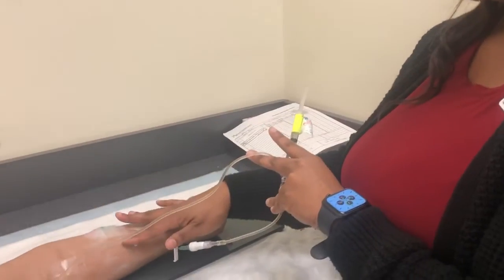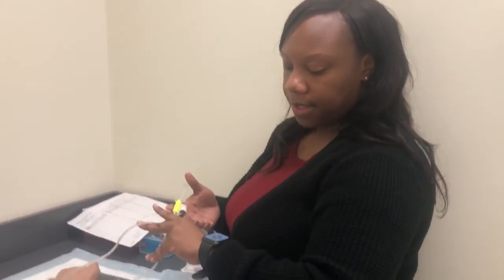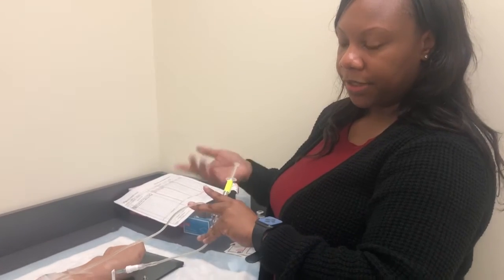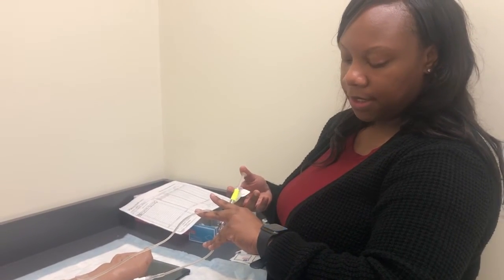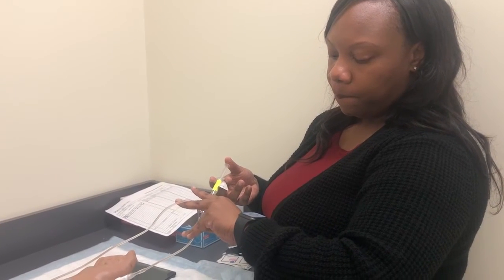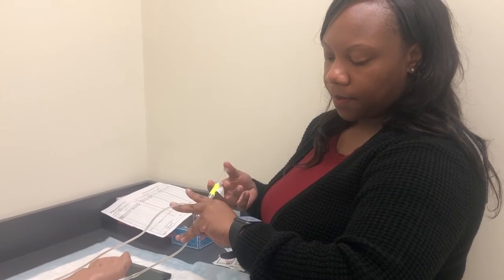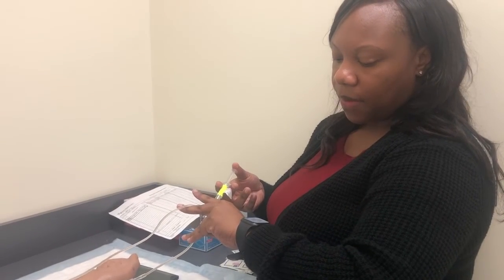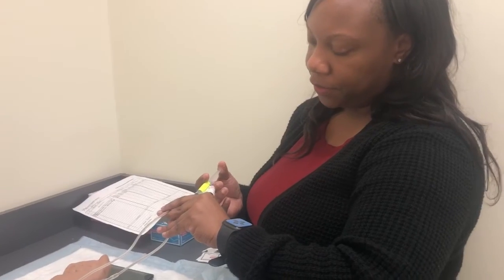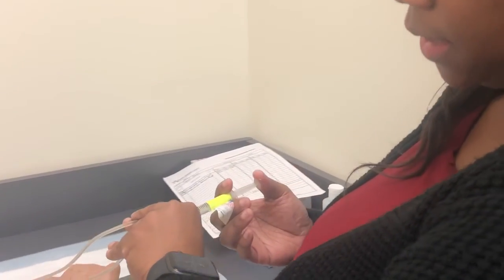I'm also monitoring my patient for any discomfort, making sure that she's tolerating it well, and at this time she is tolerating it well, so I can continue for the next minute, which I will administer for 30 seconds and release for 30 seconds. Alright, I will pinch off and administer 1 and 1/2 over 30 seconds.